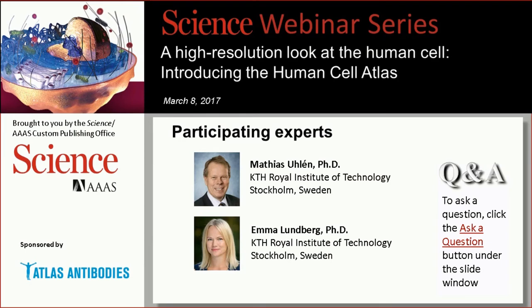And following on from that, fixation of samples, especially before immunocytochemistry and immunohistochemistry, can affect the localization and intensity. Is this important? Is it something that you look at when doing these experiments? Yes, we have a publication on that, or several publications on that. So we look a lot at that, and we know that the fixation and permeabilization, of course, affects your results.